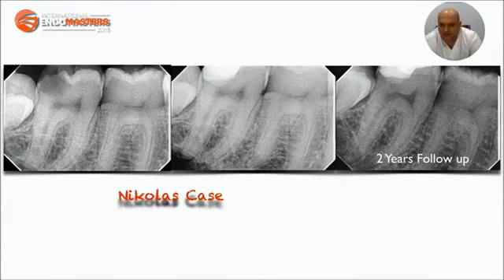2 years later, comparative radiographic evaluation suggests that the regeneration of the odontoblast complex was achieved successfully at the site of the initial pulp exposure. Amazing regenerative potential of young pulp. And if you have some doubts about the dentine-pulp complex regeneration in Nicola's case being that evident in the follow-up radiograph, in the next case of partial pulpotomy, the regeneration will be evident even for the most strict reviewer.